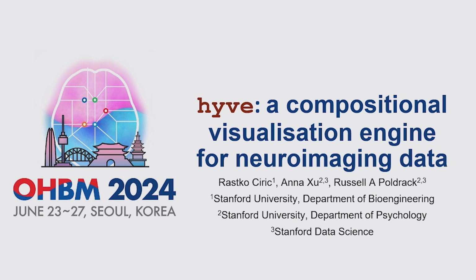So I'm going to talk a little bit about a visualization software that I've been working on over the past year or so.